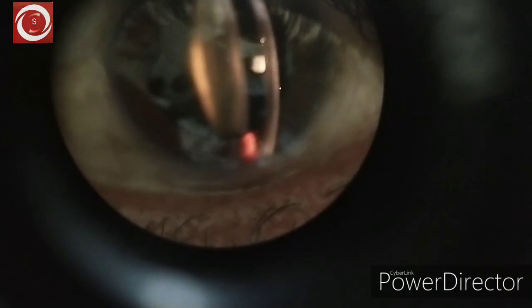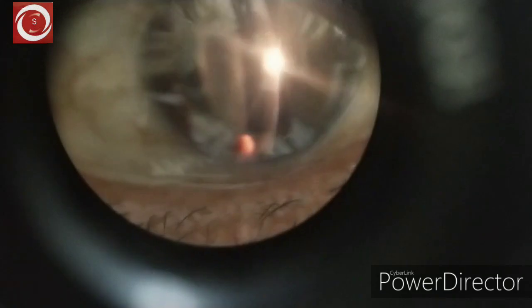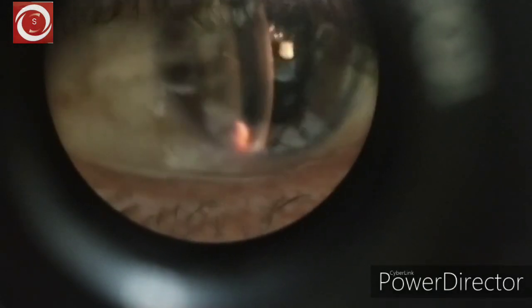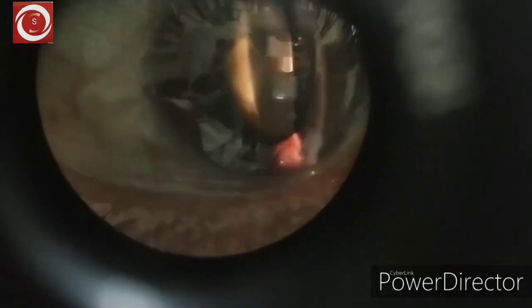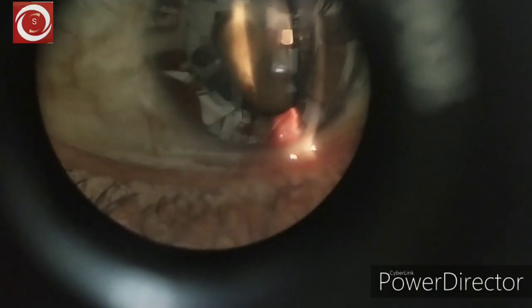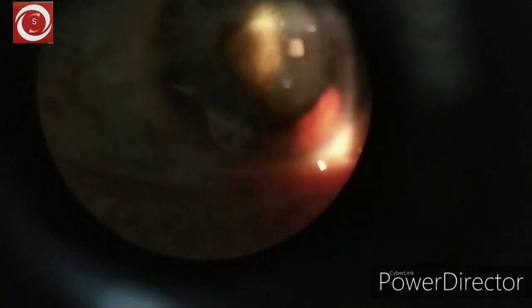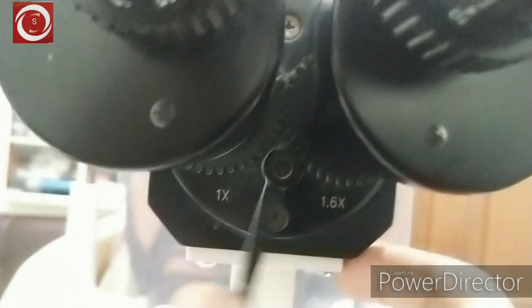That's the oblique illumination. You can now clearly see the anterior chamber, the corneal slit — the anterior-most on the right side is the corneal slit. Then the anterior surface of the lens, and the distance between the posterior cornea and anterior lens is the depth of the anterior chamber. The last white one is the posterior capsular opacity — that's how you examine with oblique illumination.